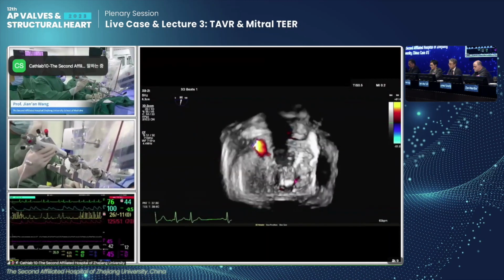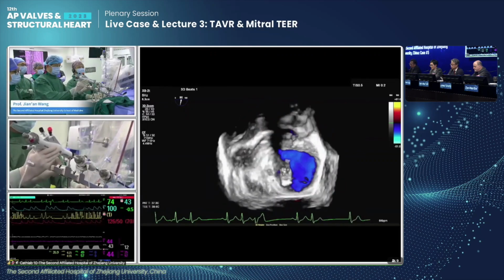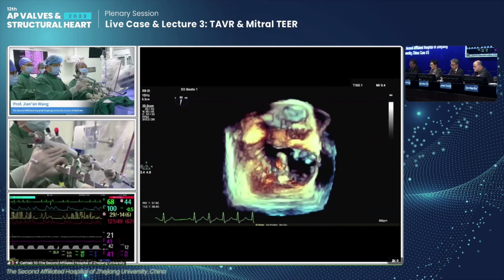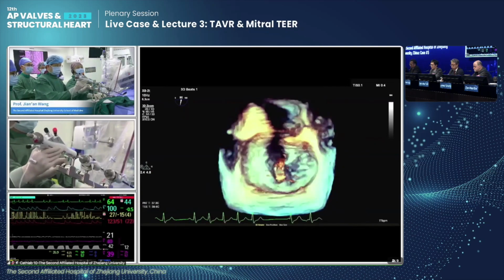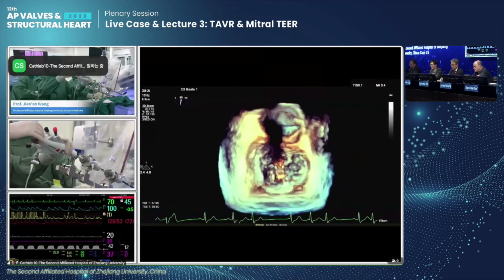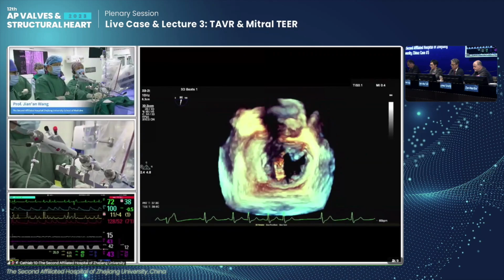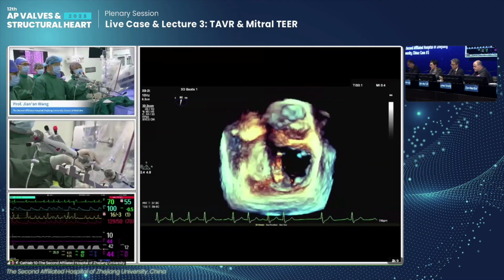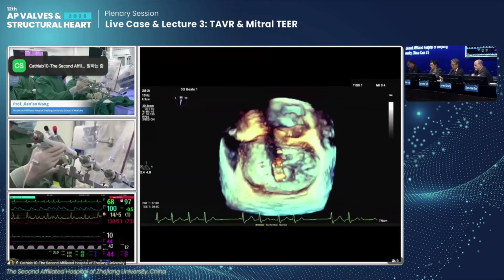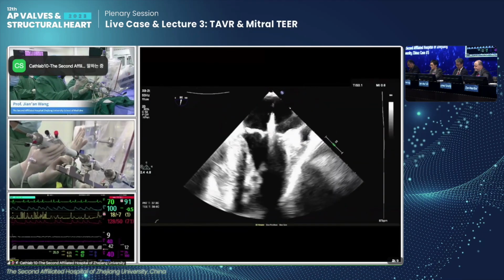The blood comes out from this side, I see. Yeah, I think you're splitting the jet. So maybe it's too lateral. I see, maybe we have not yet gotten the true correct orientation. It should be a little more clockwise. It's not imaged clearly yet. Yeah, looks good.